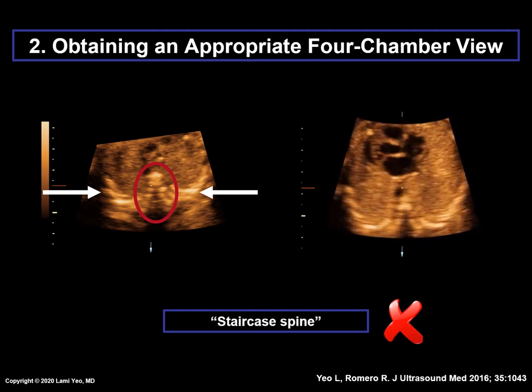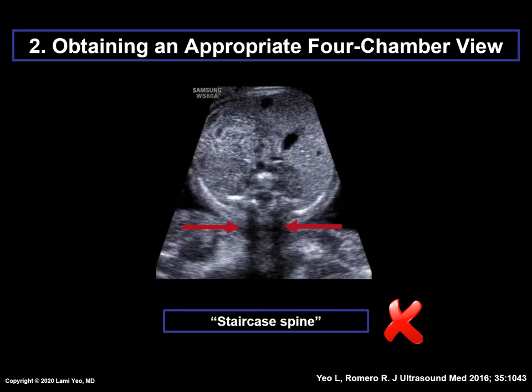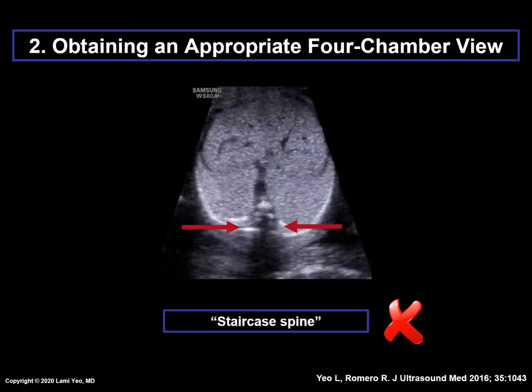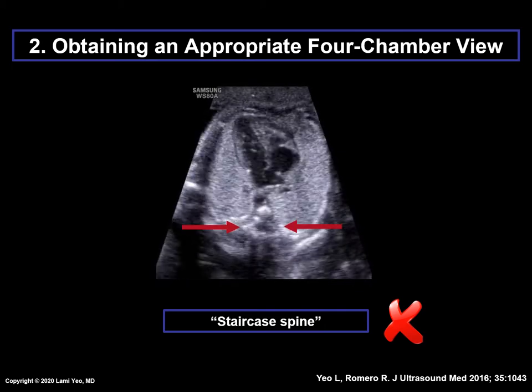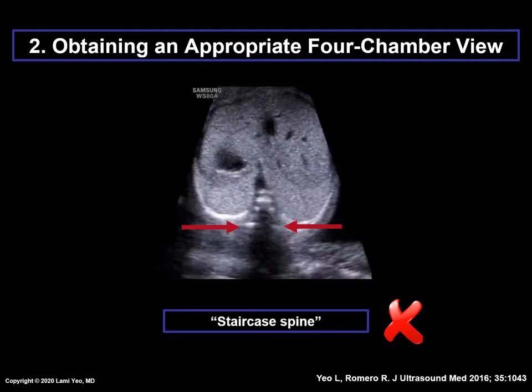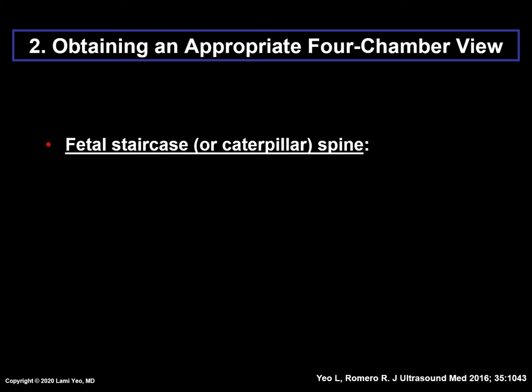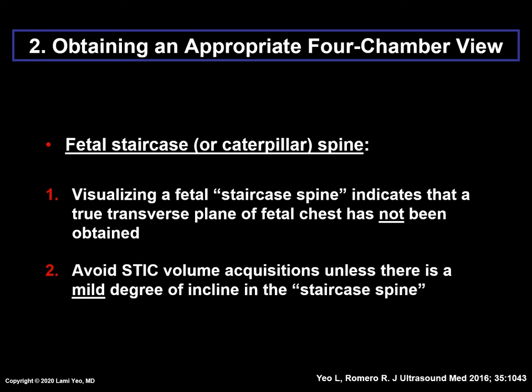Here is an example of no staircase spine. The fetus is completely supine, in vertex presentation, and a longitudinal lie. As the transducer sweeps from cranial to caudal ends, the fetal spine is always located at the same area on the screen with its three ossification centers visualized in each serial transverse plane — in this example, always at 6 o'clock. In contrast, with a staircase spine, the spinal ossification centers are stacked upon each other like a staircase or caterpillar, and the curved ribs are also seen. Visualizing a fetal staircase spine indicates that a true transverse plane has not been obtained; therefore, avoid STIC volume acquisitions in this situation unless there is only a mild degree of incline.